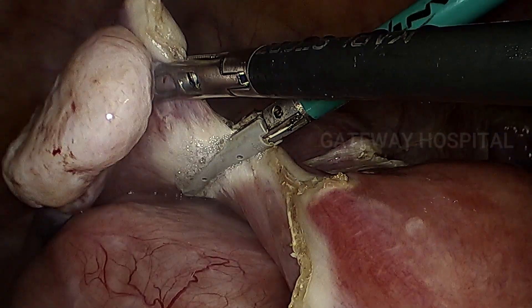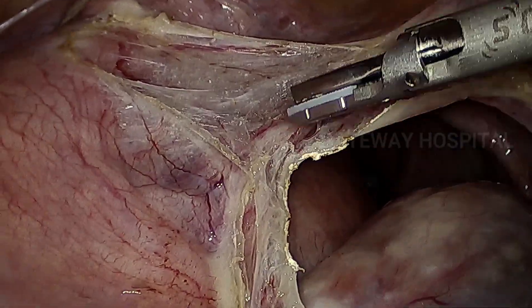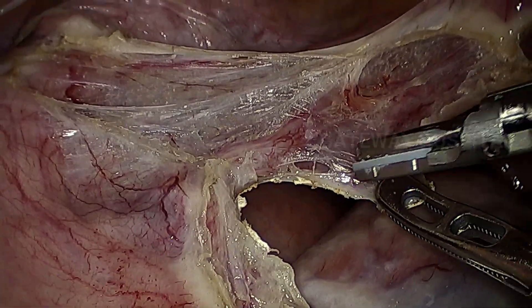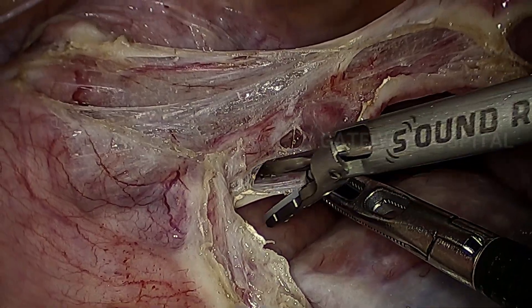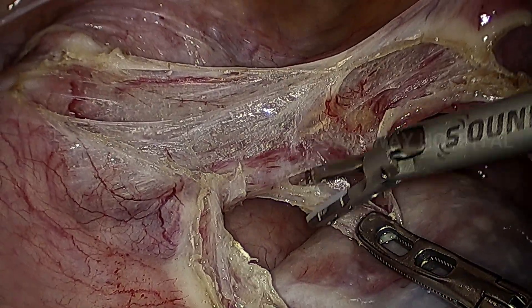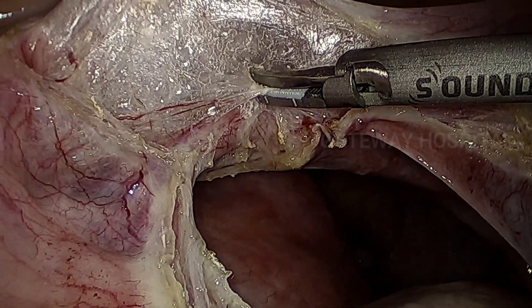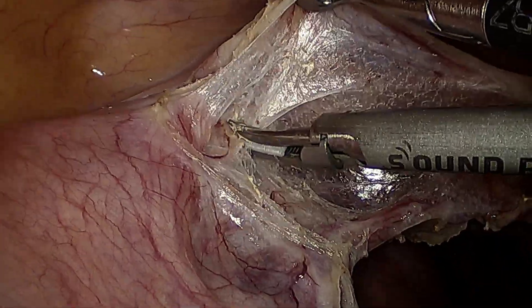While dividing this broad ligament, you have to be very careful. We have come to the right side, and you can appreciate the uterine vessels coming into view. The fibroid is sitting behind, and the stretch with the left hand helps in opening up the plane so that we can mobilize the bladder further downward.